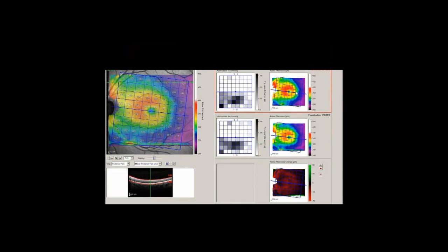Here is a patient who showed extensive thinning in macular thickness from one visit to the next. But since there is no arcuate shape in the thinning and there appears to be some supernormal thickening previously, we found this was simply resolution of diabetic retinal swelling — no frank diabetic edema, just improvement in blood sugar control resulting in a normal-appearing macula compared to a thicker-than-normal appearing macula.